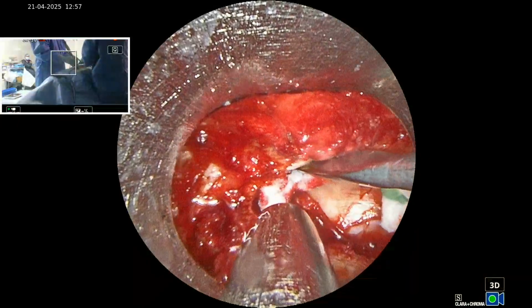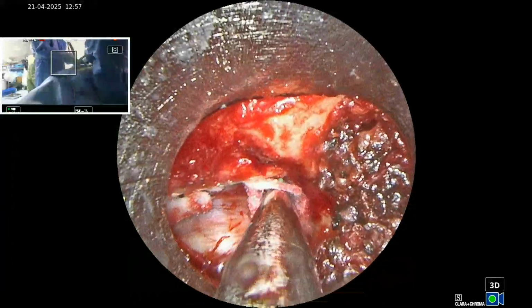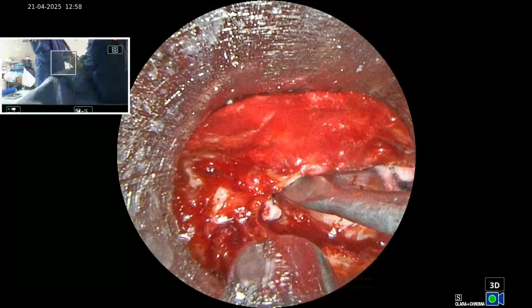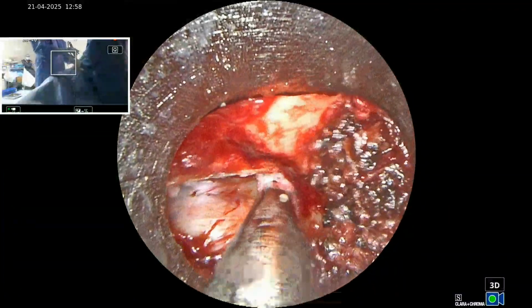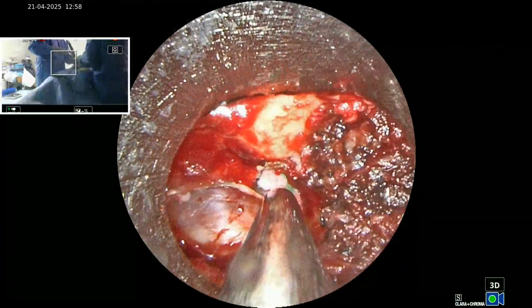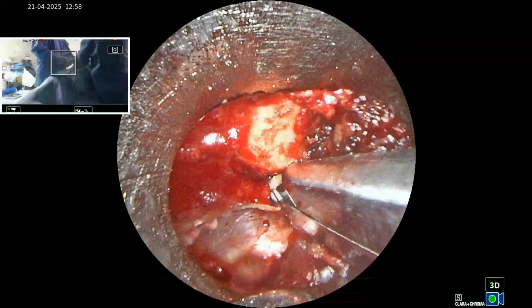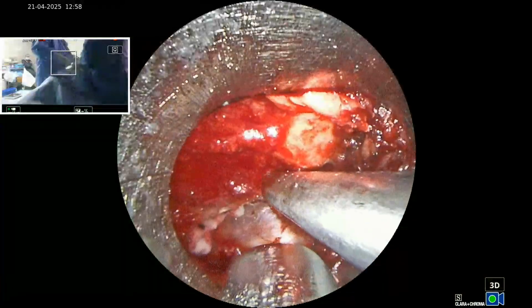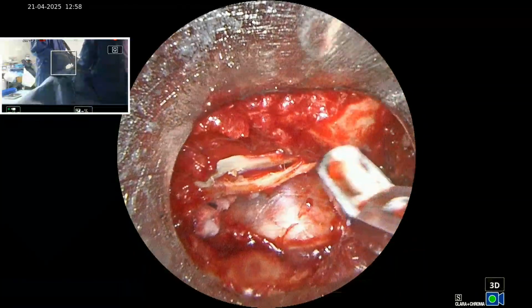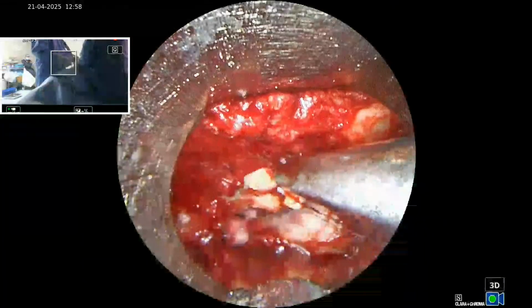So now we'll go to midline. We have done the decompression of the nerve root, foraminotomy of the right side, and done the discectomy also. This is my midline. Now we'll decompress the midline structures, meaning a bit of the undersurface or undercut hanging of the midline structures.